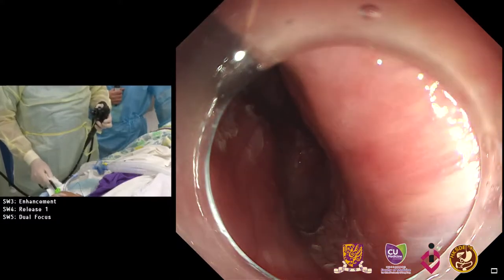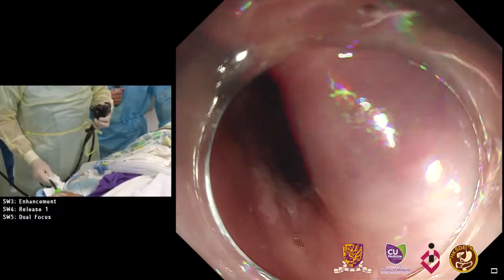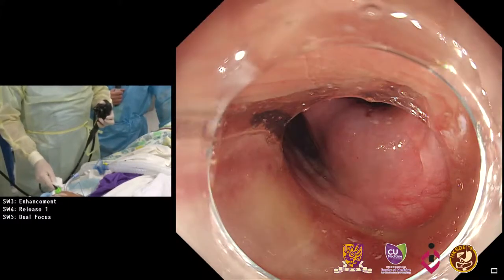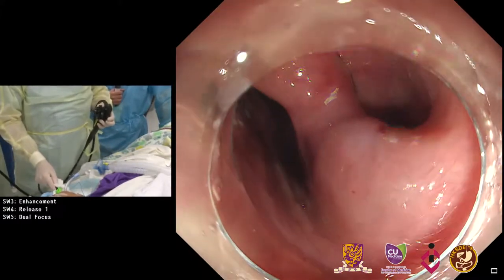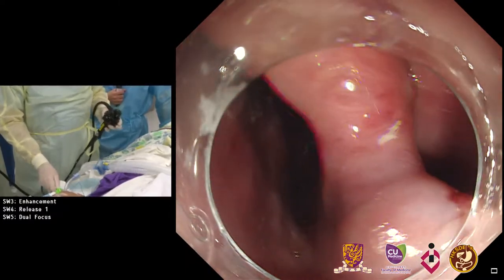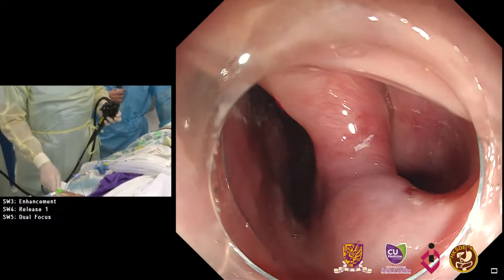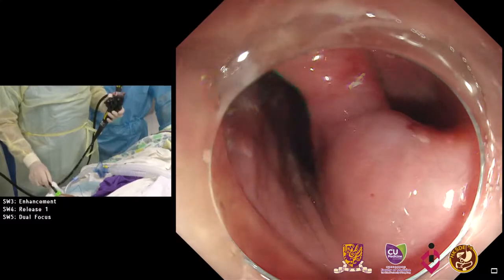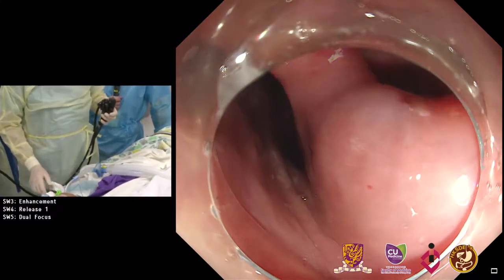There were a lot of debris and noodles and a lot of food inside. This is almost clean right now, and you can imagine the patient has some problems with swallowing and coughing. What we do now is start with the septotomy.